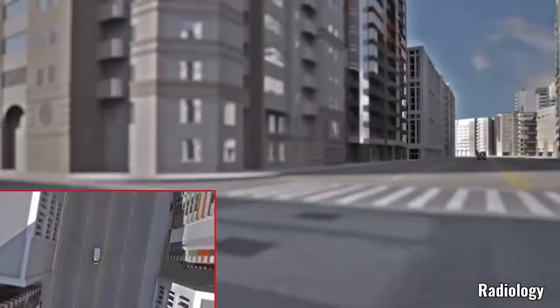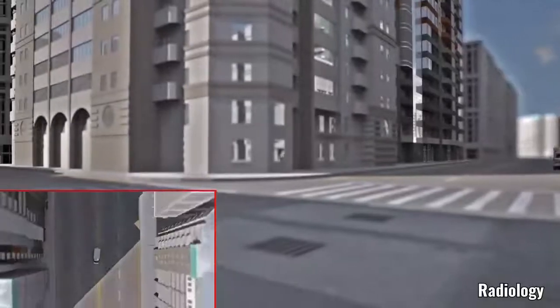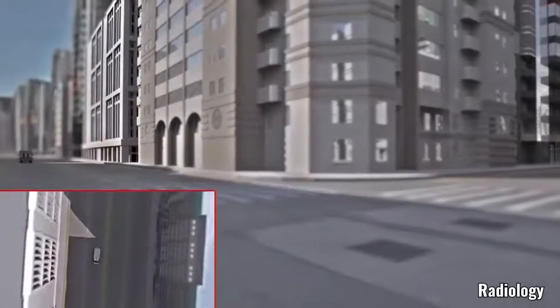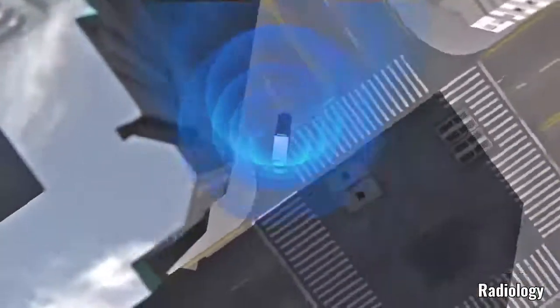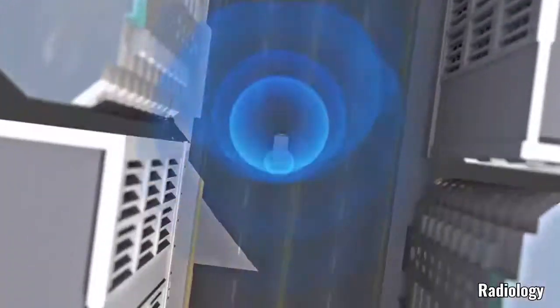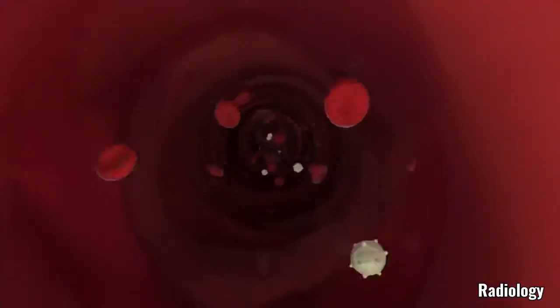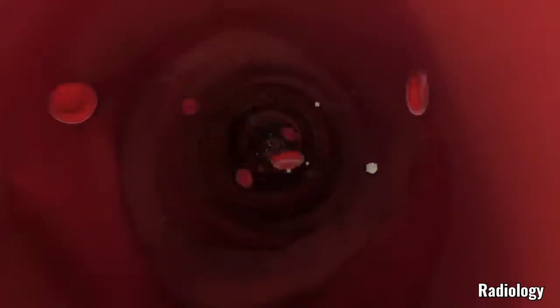If you've ever listened to how a siren sounds as it approaches, passes, and drives away, you are hearing what's called the Doppler effect. The waveform is compressed as the ambulance approaches, making it sound higher pitched, and it's stretched as the ambulance departs, making it sound lower. Doppler ultrasound uses the same principle to determine the speed and direction of the blood inside your arteries.